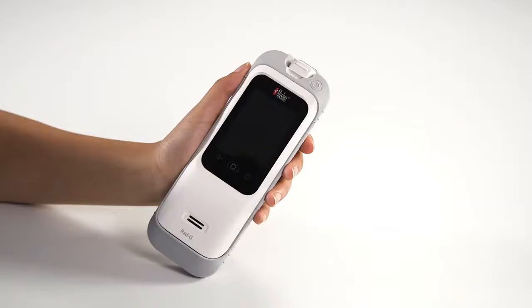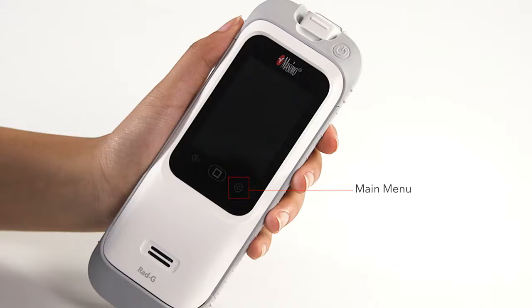The RadG controls are comprised of a color touchscreen interface, an on/off button and main menu, and home and backward navigation buttons.